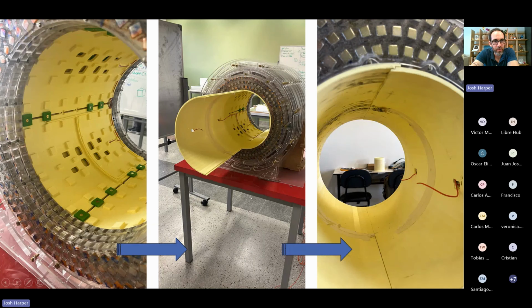After we wire all the gradients, we have to get them inside the coil. So here we have a brilliantly designed way of putting these gradients in. They overlay each other and snap into place inside the coil. And then the very last gradient, which was the X gradient, just about slides in with a little bit of difficulty. The photo I've taken here is from before I fixed it. These two pieces were actually overlapping. They don't do that anymore, but getting this gradient into place was a challenge because they fit just perfectly. But this is the process of sliding the gradients in.